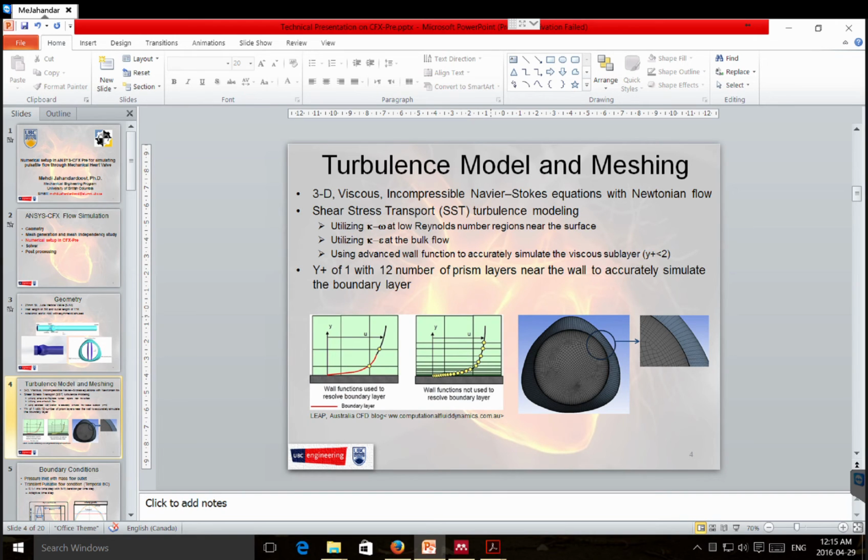For the mesh generation, first of all, I have chosen shear stress transport turbulence modeling. This turbulence model is utilizing the K omega in low Reynolds number regions near the surface and K epsilon at the bulk flow. This specific turbulence modeling is using advanced wall function, but in order to be able to capture the viscous sublayer, you have to choose Y plus lower than 2. I have chosen Y plus of 1. As you can see, it's very fine mesh close to the surface with 12 prism layers near the wall.